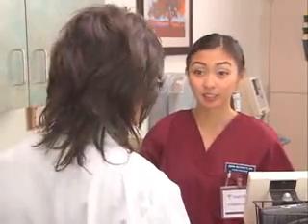Right. And while you're measuring the patient's blood pressure, what do you assess for? Throughout the procedure, I look for signs and symptoms of hypotension, such as dizziness and lightheadedness. And don't forget pallor and diaphoresis. If the patient would be attached to a cardiac monitor, you would assess for arrhythmias. What do you do if symptoms appear during the procedure? Immediately have her lie down. Return the patient to a supine position. Right. And do not have the patient stand if symptoms of hypotension occur when the patient is sitting. Because they could faint and fall and get hurt.